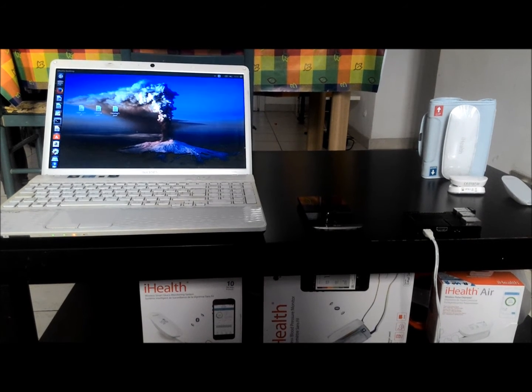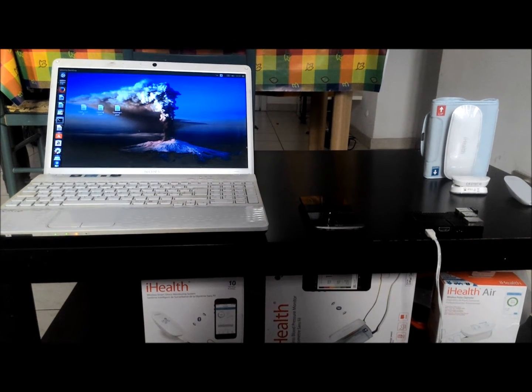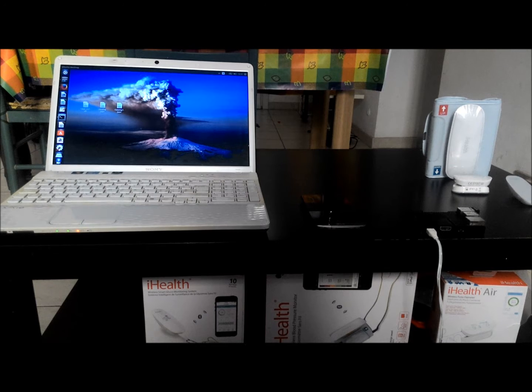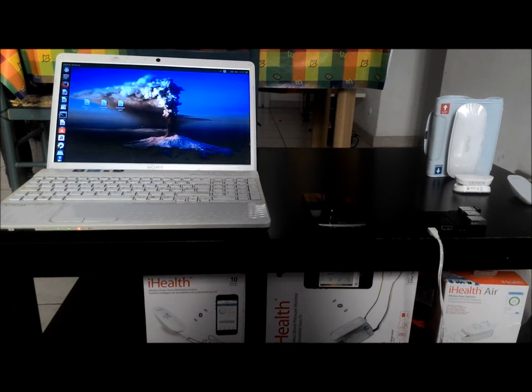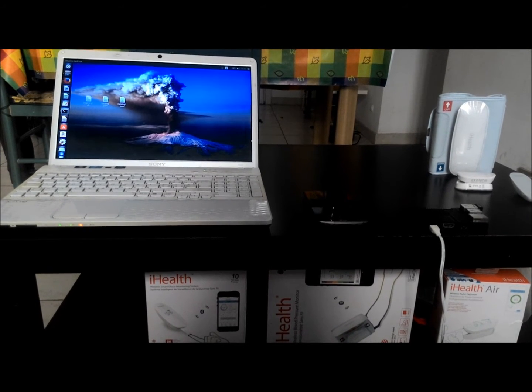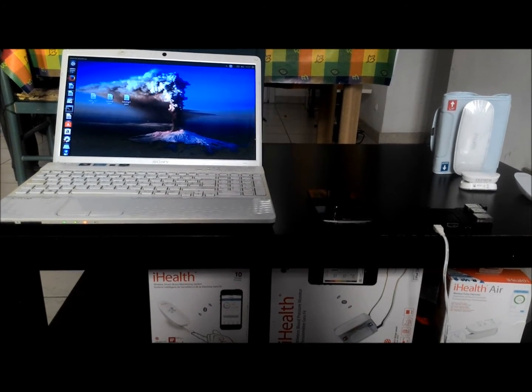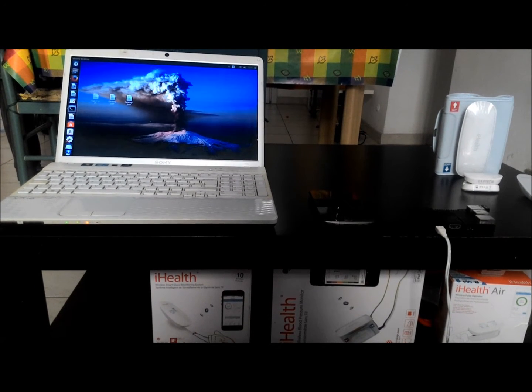Okay, this is the setup. We have on the right the iHealth smart sensors: the blood pressure smart sensor, the glucose level one, and the blood oxygen one. Then we have our Raspberry Pi switched on with a Wi-Fi module, so it is connected to the Wi-Fi. It has a static IP set.